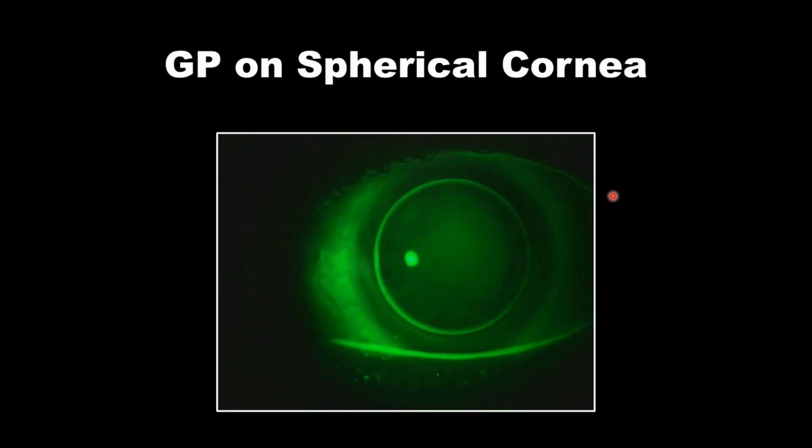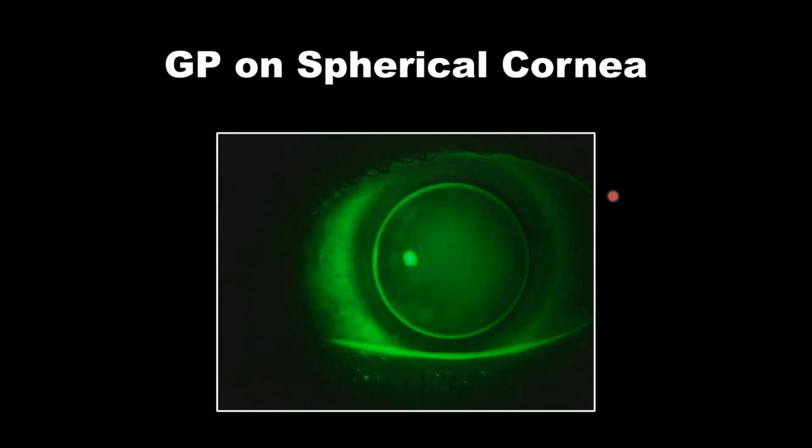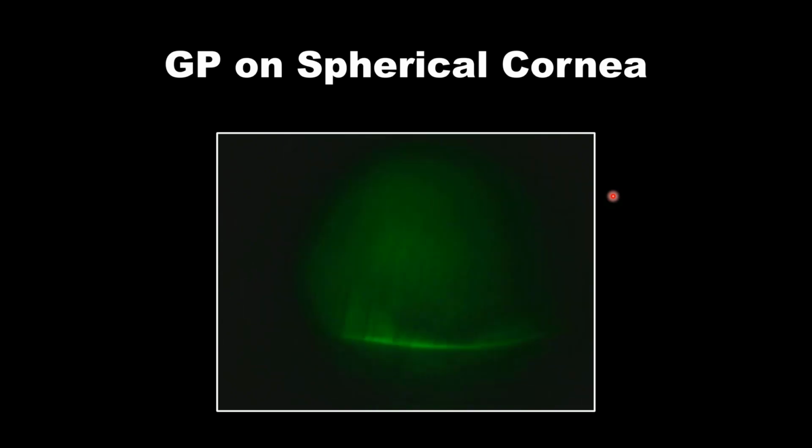So when you place a rigid contact lens on this patient, it's very likely to find good alignment all the way around. And any movement that exists might be due to that tiny 8 micron channel that exists along the steep meridian of the eye, the 8 microns deeper that you are across the steep axis.